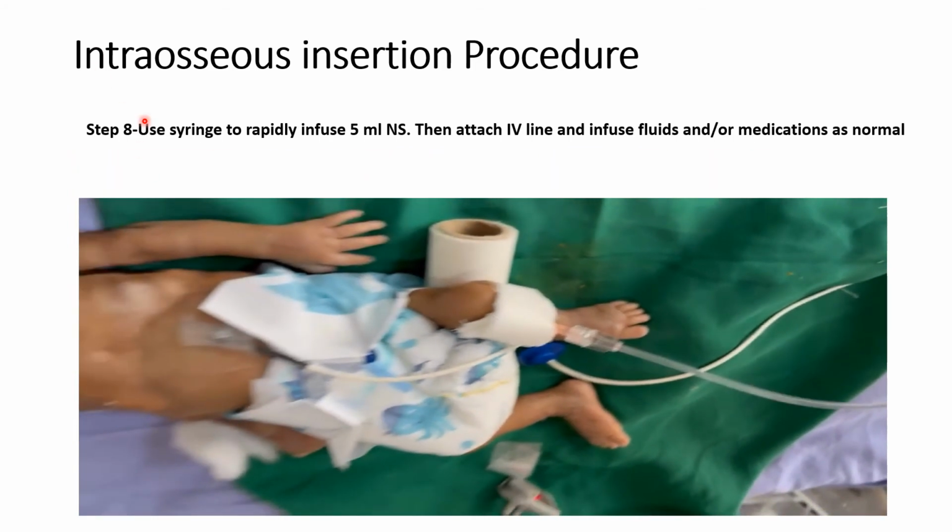Then you have to use the syringe to rapidly infuse 5 ml normal saline. And here you can see I have attached the IV line, and we can run continuous IV fluid or we can give the medication by the IO.